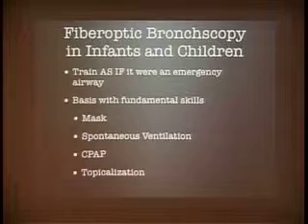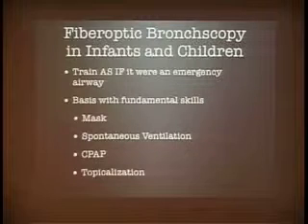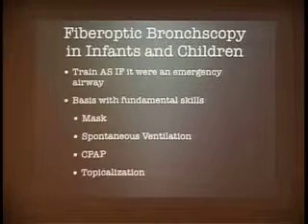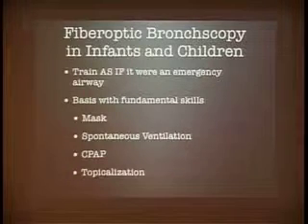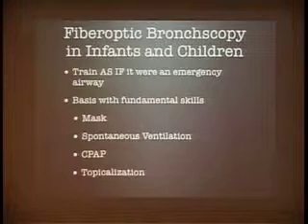What we do have, and it's a mandate, is that every single trainee that comes to us, SRNA or resident or fellow, must have gone through our difficult airway training at our SIM center. And there are I don't know how many hours in fiber optic muscle memorization. If they don't have that, we don't teach it.